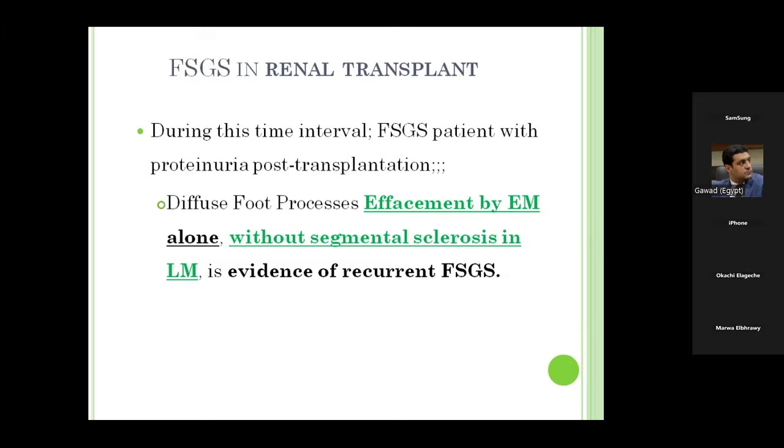Diffuse effacement under EM alone without segmental sclerosis in light microscope is evidence of recurrent focal segmental glomerulosclerosis with a known primary, before being transplanted.